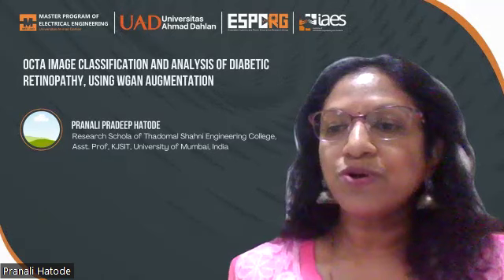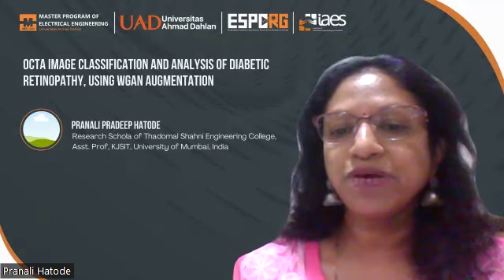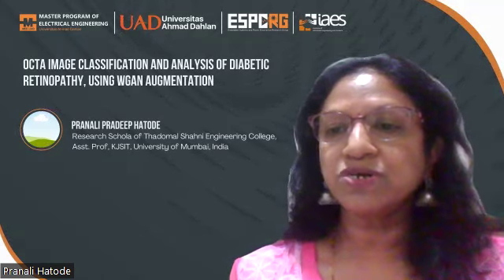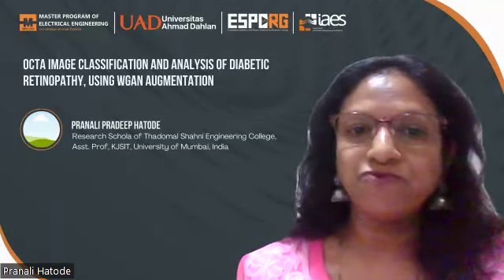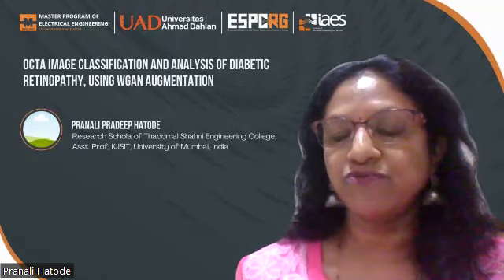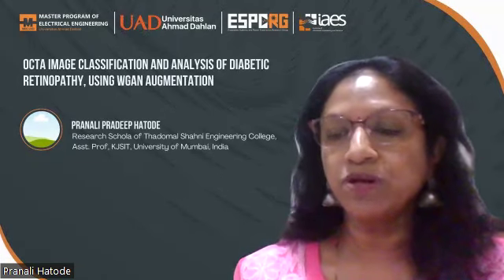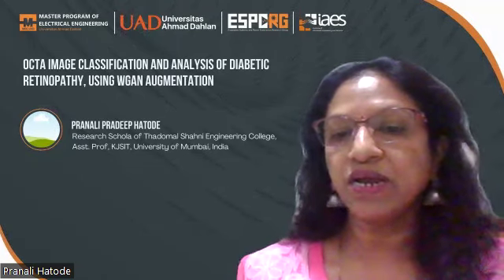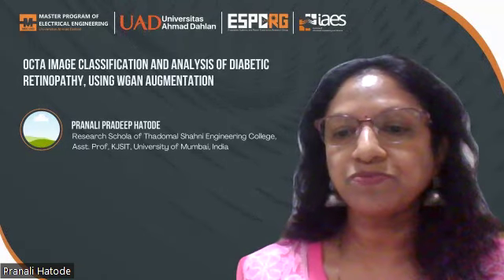The critic goes on calculating the loss function of the fake image on the basis of the real image database which it has. This loss function is given as feedback to the generator. The higher the loss, the more accuracy is needed in the fake image. The generator goes on adding realistic elements to the fake image, and in this way, more and more realistic synthetic data is generated out of WGAN augmentation.